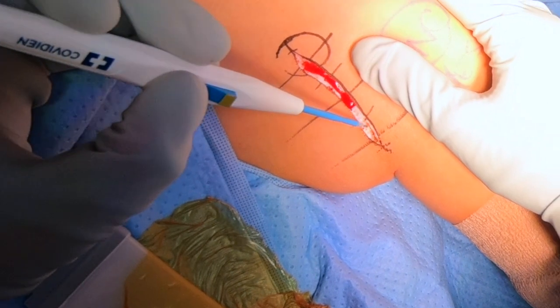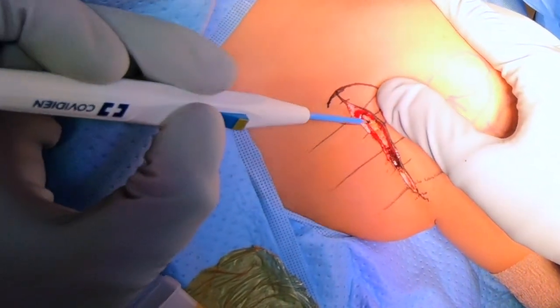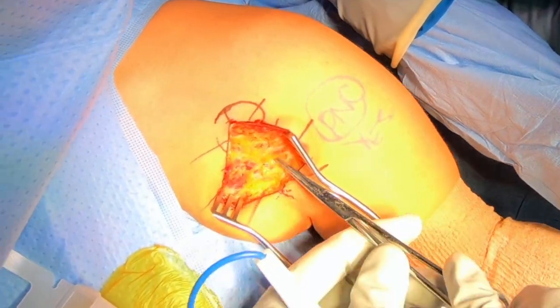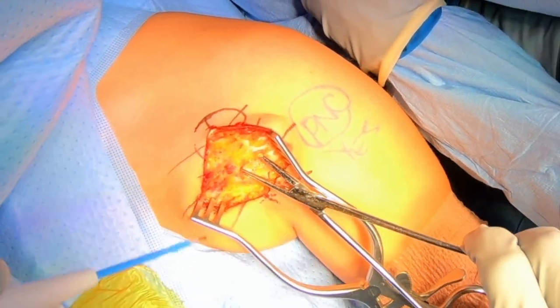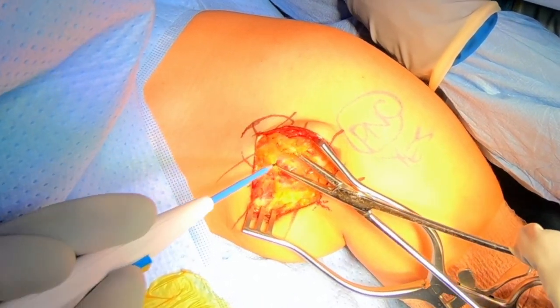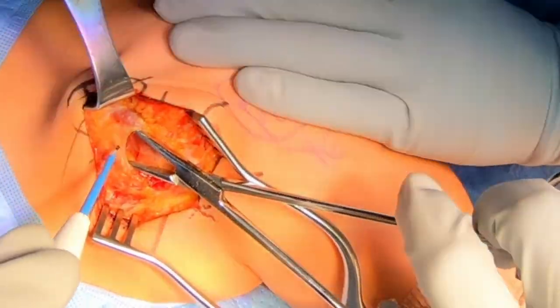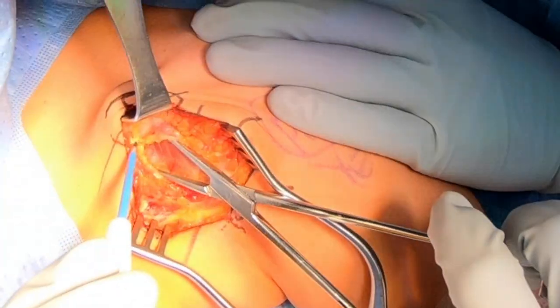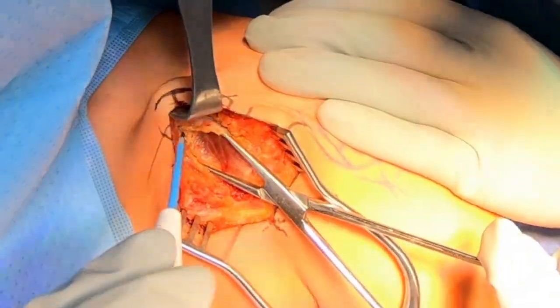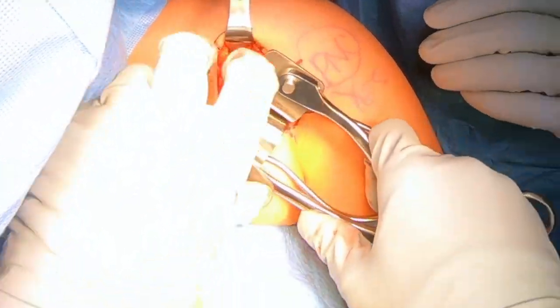After dissecting the subcutaneous tissues with electrocautery, this will allow us to make sure there's no bleeding so that we can have a clear surgical field. We'll begin here dissecting between the deltoid muscle on the right and the pectoralis muscle on the left. There's a big vein in this region that we'll dissect through to make sure that we can preserve it. You can see here us dissecting between those two muscles and putting in retractors so we can see exactly what we're doing during the surgery.